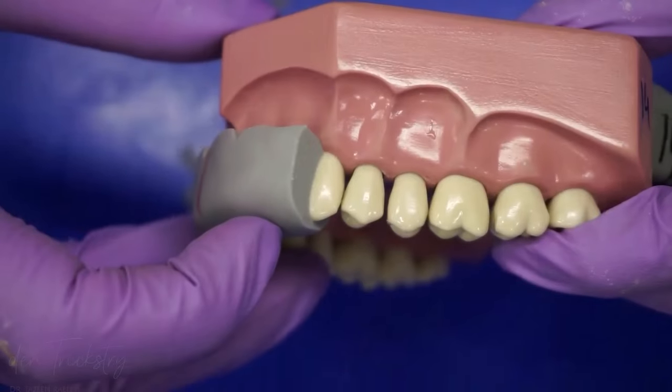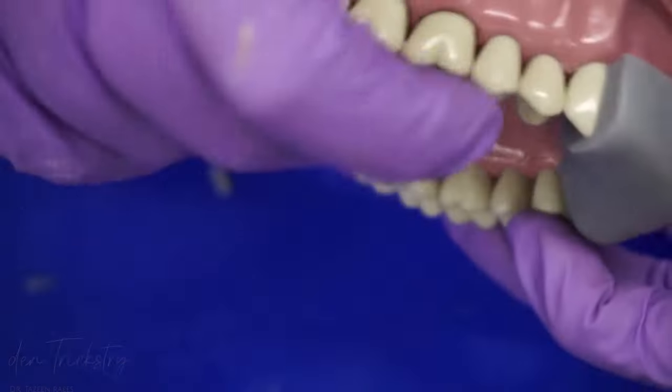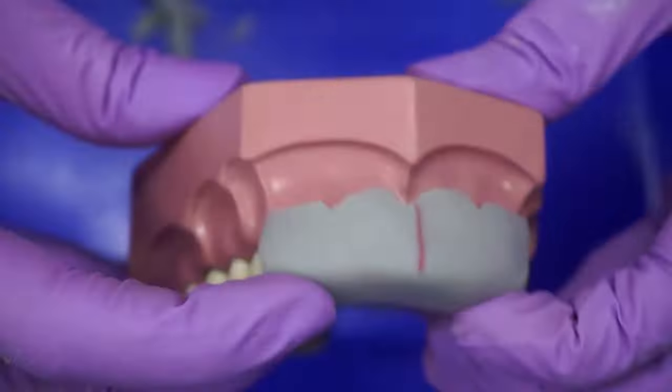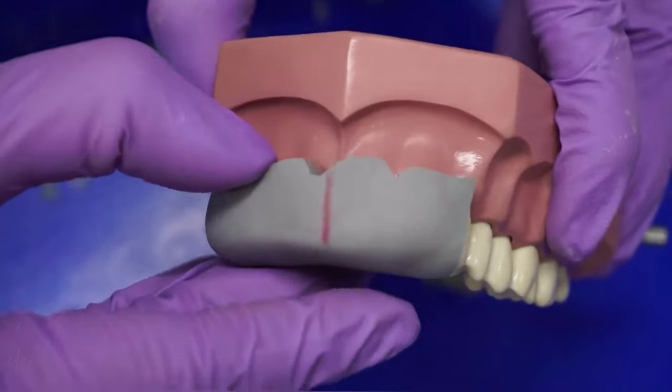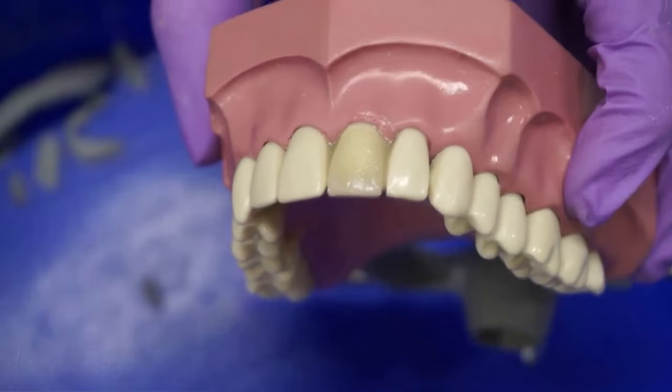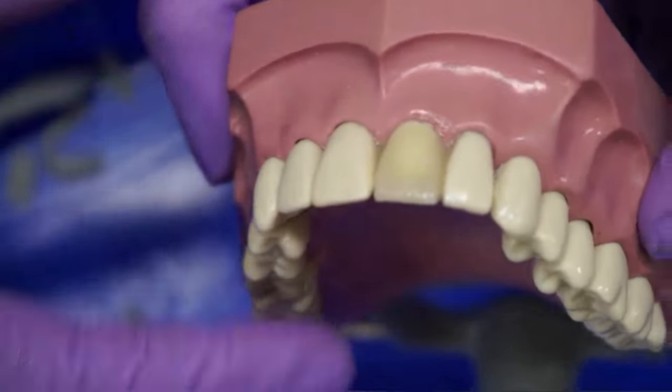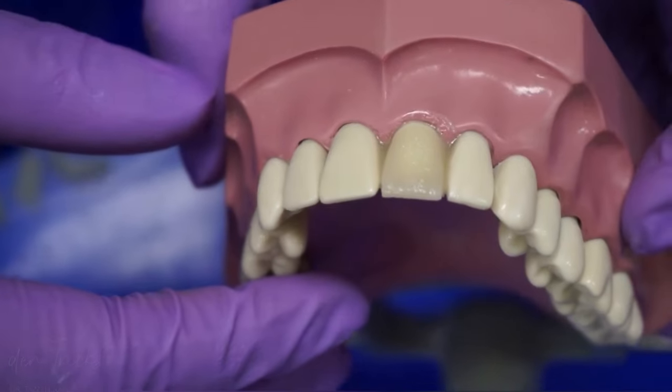Confirm that you have placed it correctly. If there is any gap between the teeth and the index, that means either your placement was not correct or the material has already polymerized. Hold the index in place gently and remove it once the material has set completely. You can confirm that the material has set by expressing a small amount of material before placing it in the index itself.